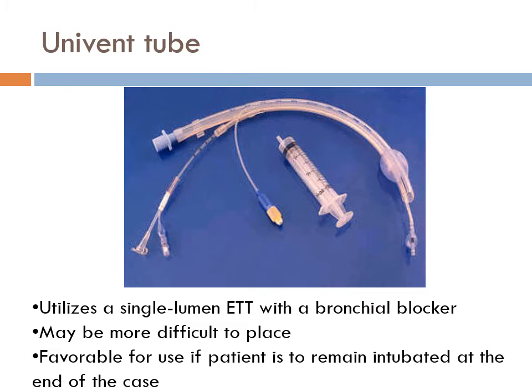So first of all, trying to ventilate air through that little bronchial blocker to let the lung go down is really hard. And sometimes during cases we have to reventilate that lung because something goes wrong, because the surgeon wants to see how their anastomosis looks. And then they're like, oh, the lung's not down. You're like, I know, it's a bronchial blocker, and they get frustrated because everyone's rushing. So that's one of the reasons that bronchial blockers have a disadvantage and annoy people.